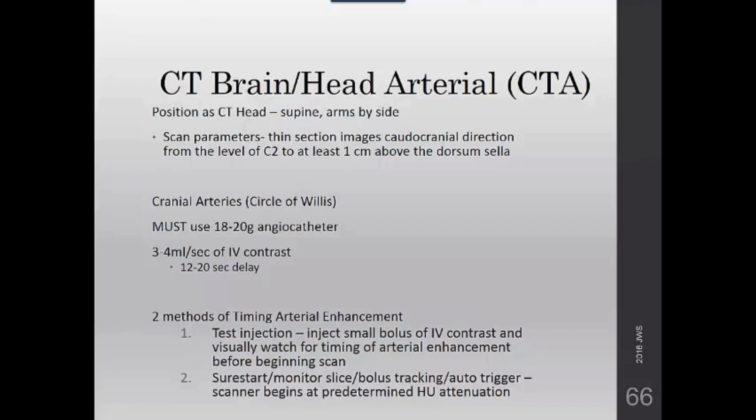Ensure proper timing of the acquisition in regard to the contrast agent bolus. The technologist has 3 methods available. It can set a delay of 12 to 20 seconds after the injection started, or a test injection can be performed where a small bolus of contrast is injected and visually observed for timing of material enhancement.